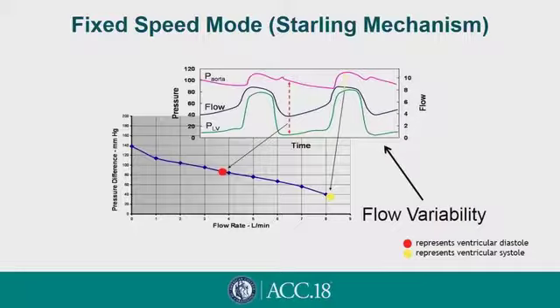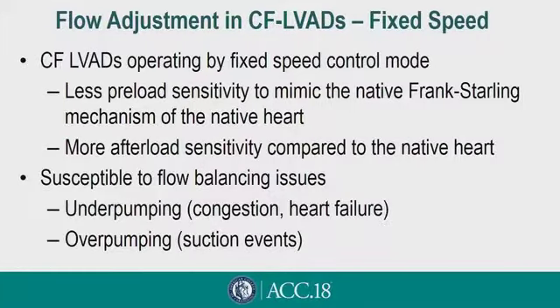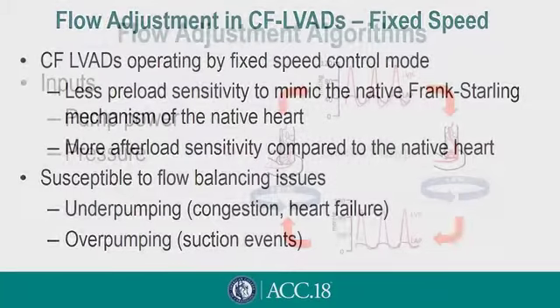So the pump has some inherent hydrodynamic properties that allow it to respond to changes in afterload or preload conditions. However, these changes are very limited. And so a pump performing in a fixed speed mode is generally less sensitive to preload changes and more sensitive to afterload changes compared to the native heart. That results in underpumping or overpumping in certain situations, which can give rise to congestion, heart failure, or suction events.